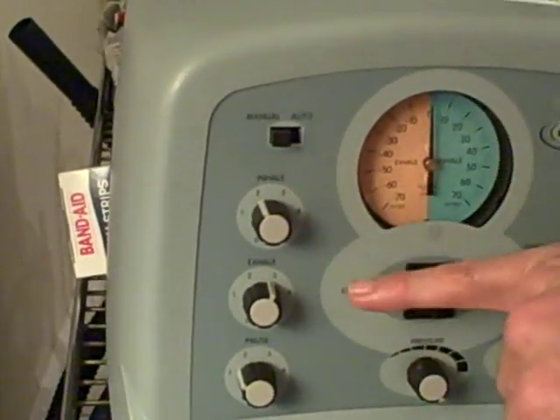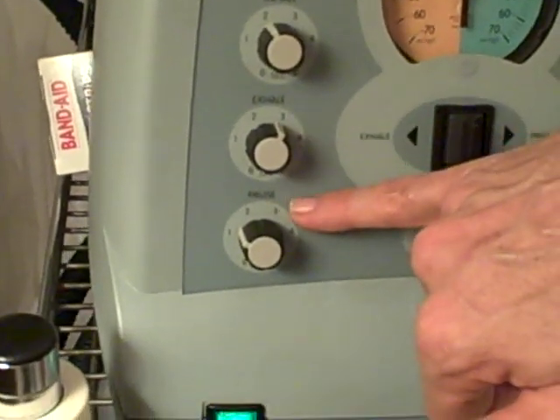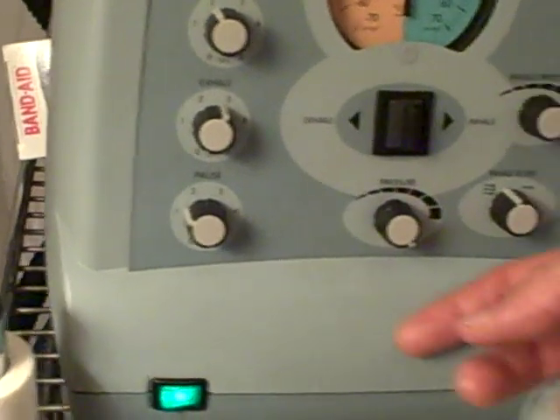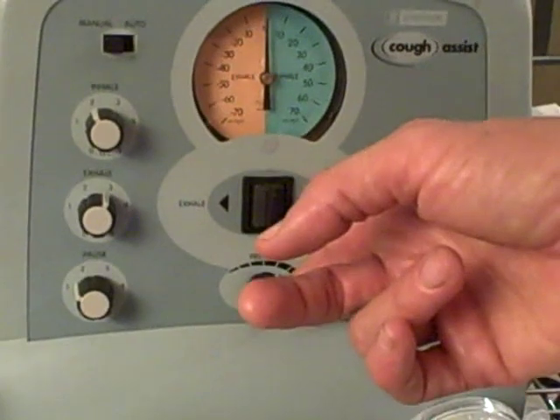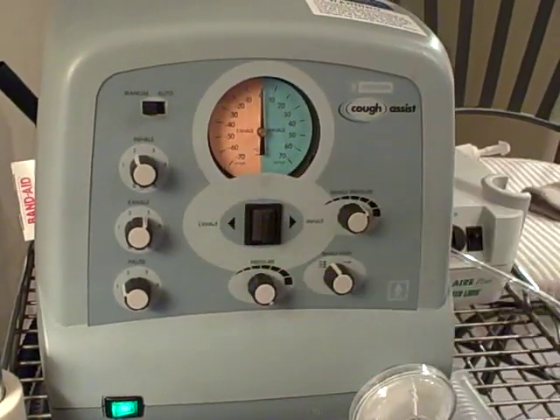We have the inhalation set at two. For the exhale we have it set at three. For the pause of the breath in between we have it set for slightly over one. The pressure can go up and down — when you start the first cough the pressure is usually lower, and then you can increase it all the way up as we go through the Cough Assist.